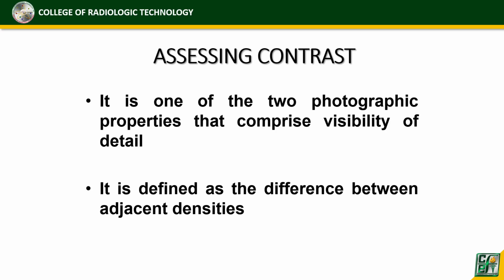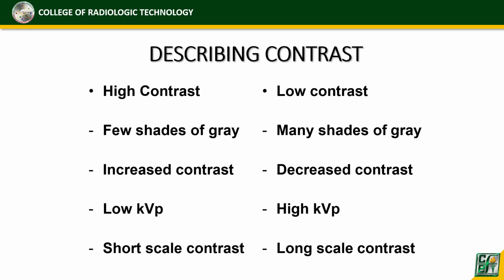It is also defined as the difference between adjacent densities. Two densities, di ba? We have the scale naman. Later we will be showing about the scale. So when describing contrast, pwede tayo mag-describe ng contrast as either high contrast or low contrast.